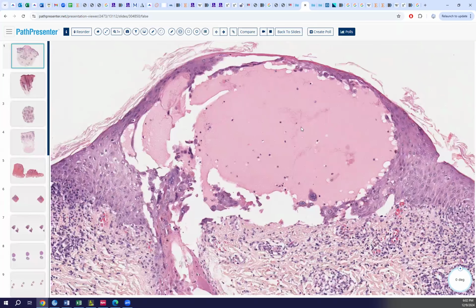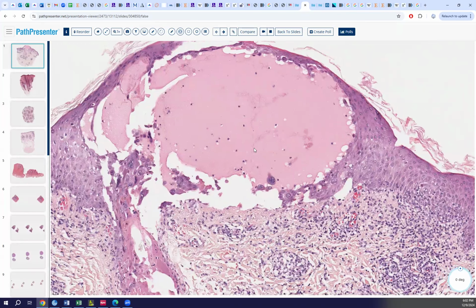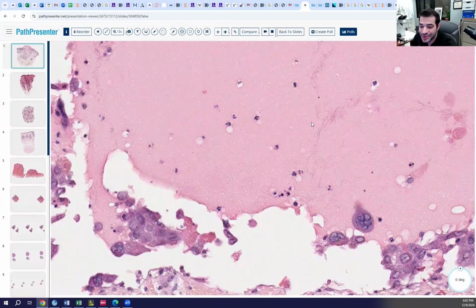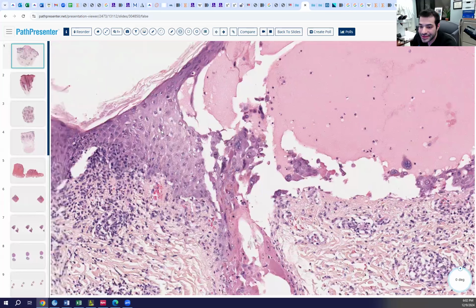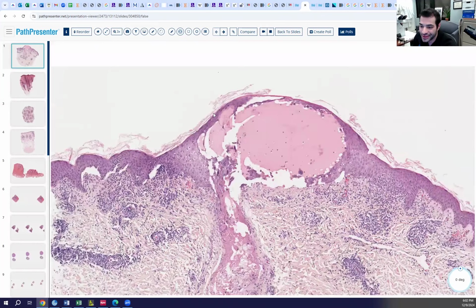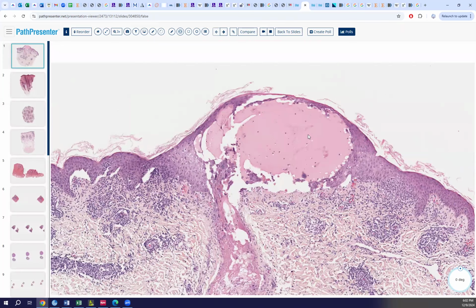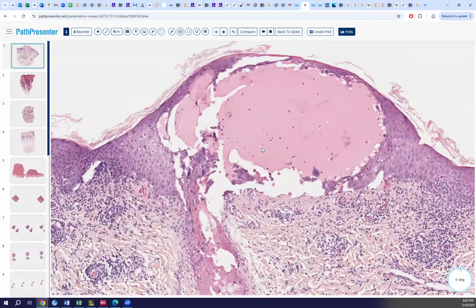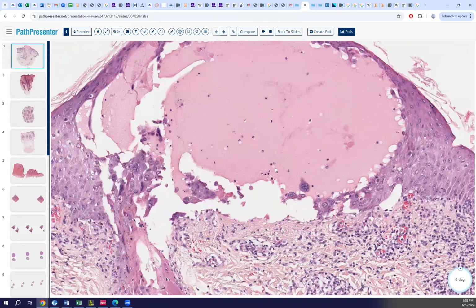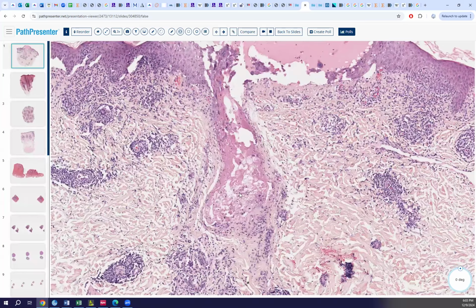And it looks like it's neutrophils as well. Yeah, there are some neutrophils in here. You could see it's a fluid-filled thing about this size. What do we call this in dermatology? Vesicle. Yeah, vesicle. It's relatively fluid filled with neutrophils, so you could say that it's pus. I mean, it could be acne.